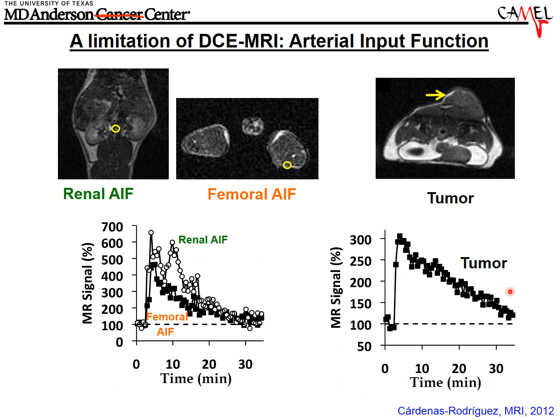So here's my first question. Why are we taking poor quality data, the AIF, and trying to make good DCMRI results through the analysis? To me, that doesn't make a lot of sense. Now, let's start with good quality data, not with bad quality data.